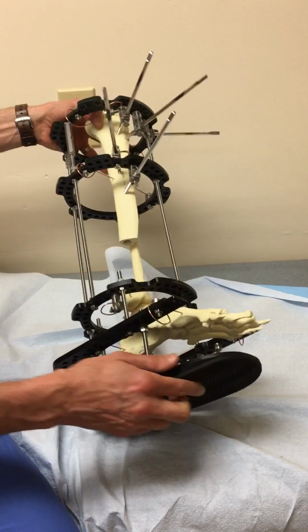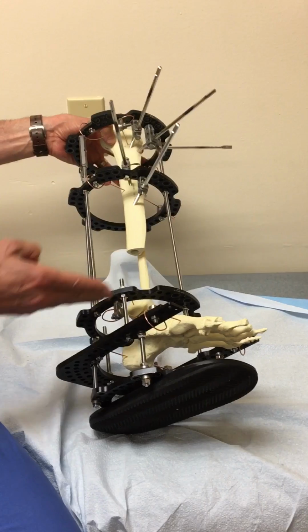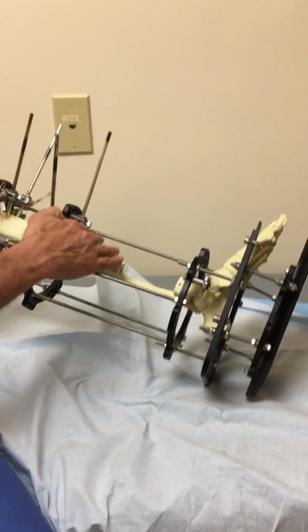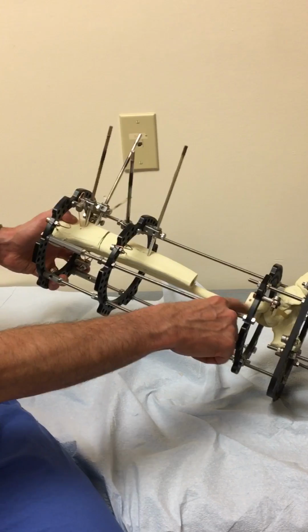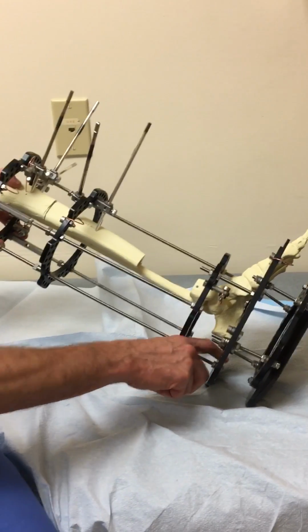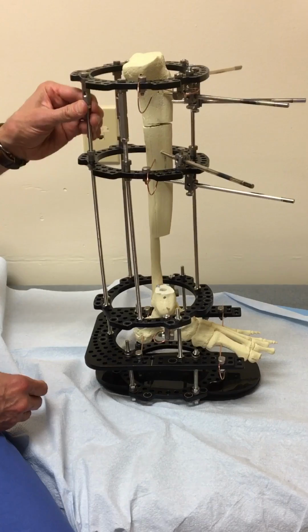And then I would recommend putting in the talus wire, okay? And adjusting it so that in the sagittal plane, it's even better than the sawbones model. I think I'm a little bit forward. The spacing is a little tight in the front here. So down here at the ankle, get that centered a little bit better, okay? Remember, you don't need much space in the back. So that's the mechanics of the frame.